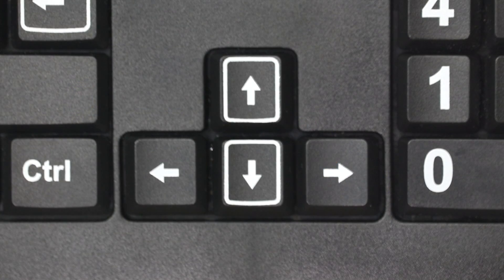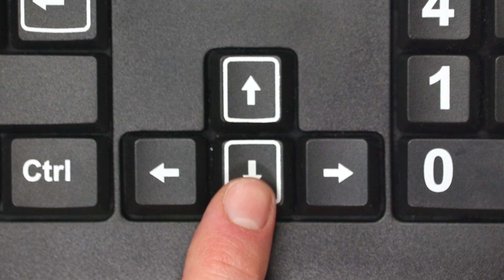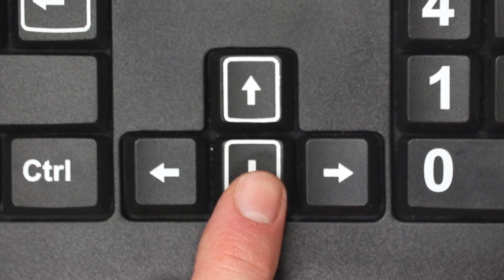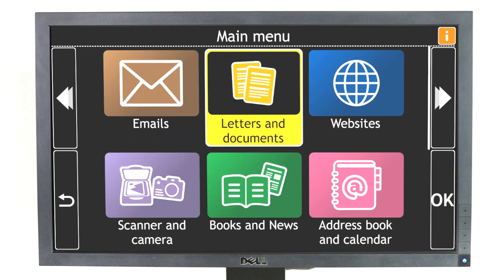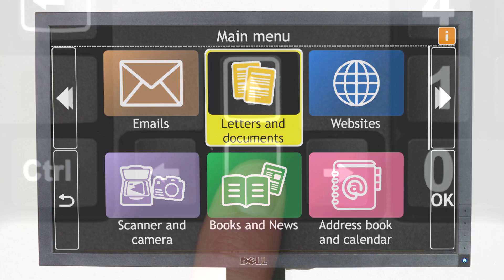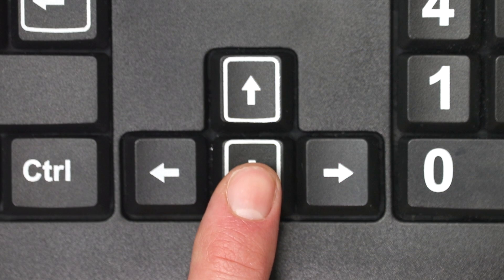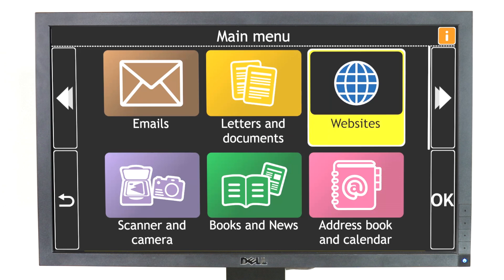The down arrow moves you to the next item on the screen. Letters and Documents, 2 of 10. To write a new letter or document, select this option. Websites, 3 of 10. To visit websites, select this option.